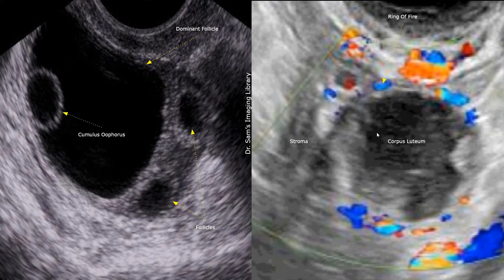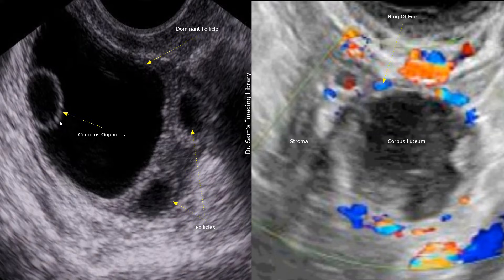This image shows a dominant follicle in the ovary. The structure within the dominant follicle is the cumulus oophorus. The cumulus oophorus is a layer that surrounds the egg and it is very clearly seen in a transvaginal image. It may be seen in some pelvic scans.